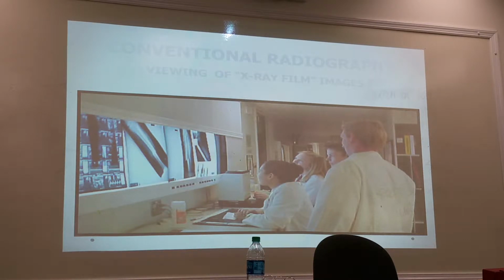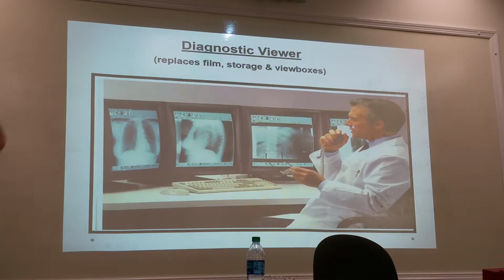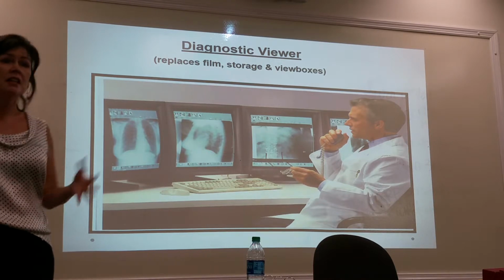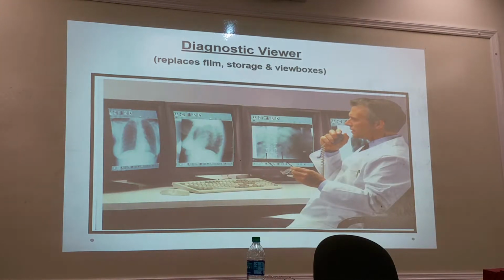So it's extremely important. So this CR came about, and it was really great in my career to see this transition. And so this was probably early. Let me just back up. The biggest problem was that the X-ray department was the last one to be computerized. CT was computerized, fluoroscopy, ultrasound, nuclear medicine, all computerized, but not radiography. These images take up a lot of computer space.